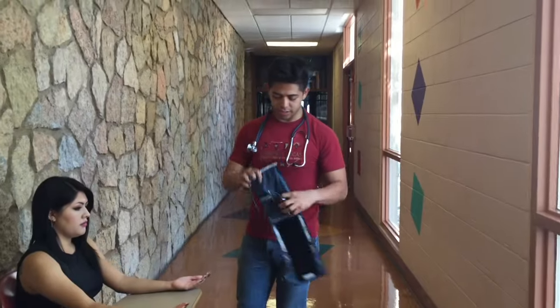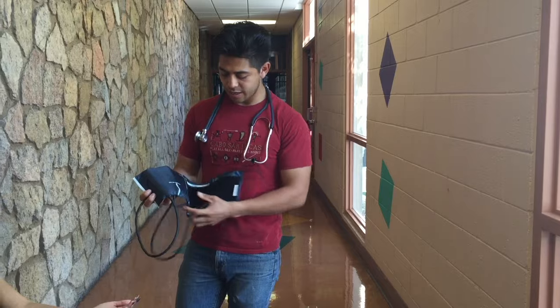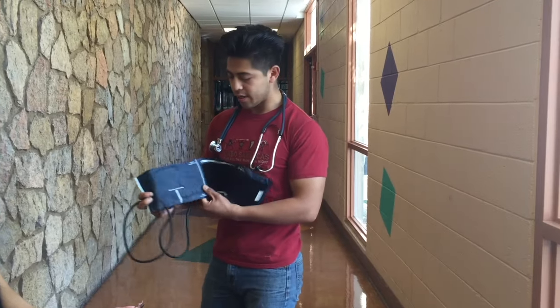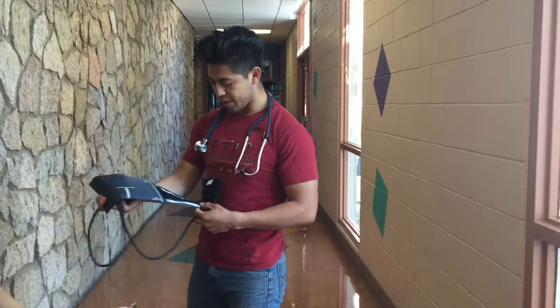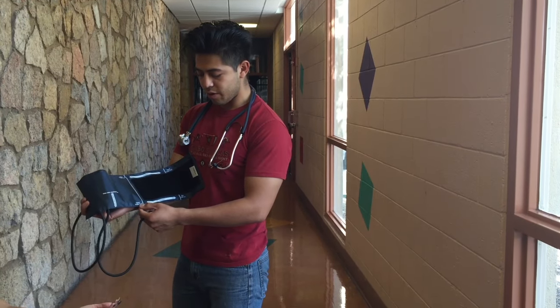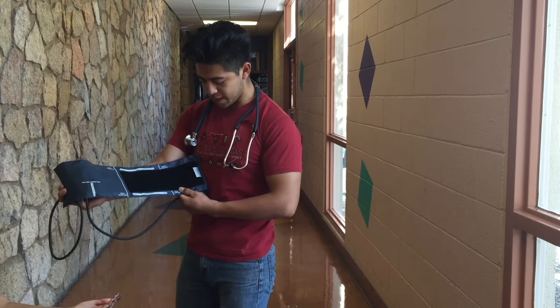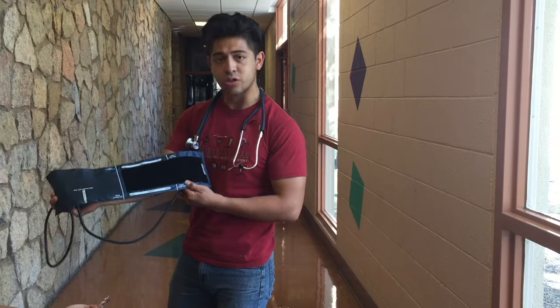Now, when choosing your cuff, you want to make sure that it's the appropriate size and make sure that the artery mark is on the brachial artery. To assure that you have the proper size, you can view here. If you pass this line, you'll have to use a smaller cuff. If you pass this line, you'll have to use the larger cuff.